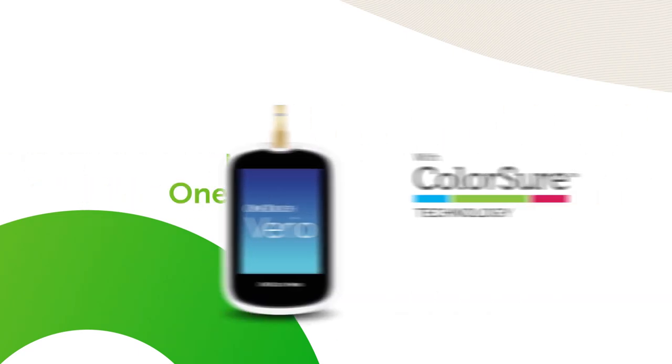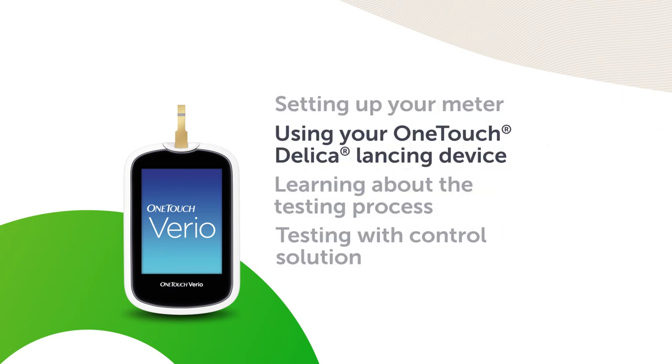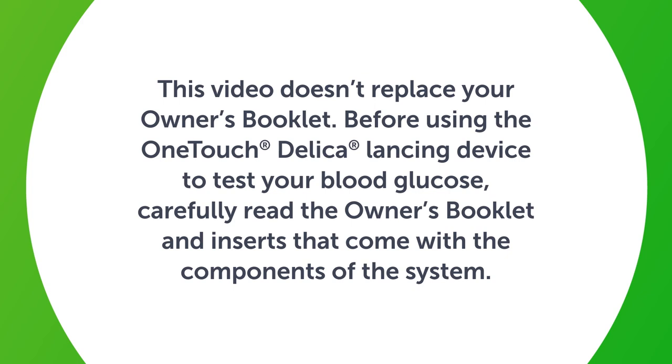Introducing the OneTouch Verio Meter with ColorSure technology. Using your OneTouch Delica lancing device. This video doesn't replace your owner's booklet. Before using the OneTouch Delica lancing device to test your blood glucose, carefully read the owner's booklet and inserts that come with the components of the system.